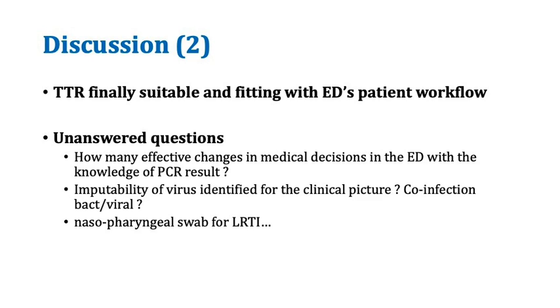Of course, we are not sure of the imputability of the virus identified in the clinical picture, and we cannot easily resolve the possibility of co-infections, bacterial and viral. Finally, we can question the suitability of a nasopharyngeal swab for lower respiratory tract infection suspicion.